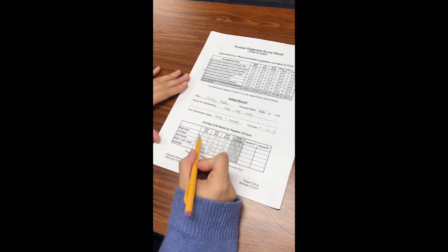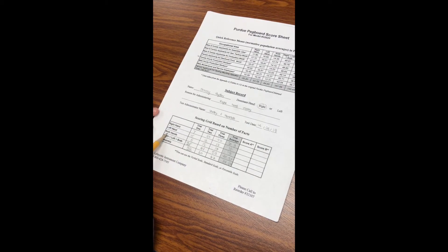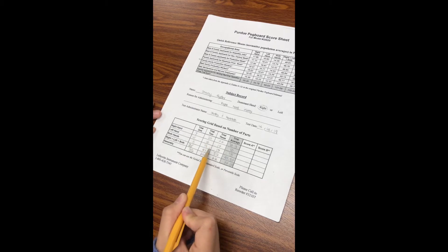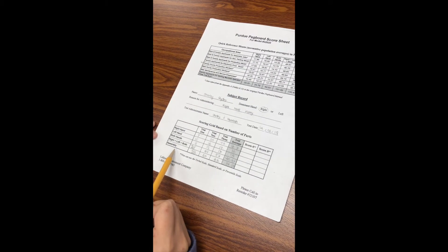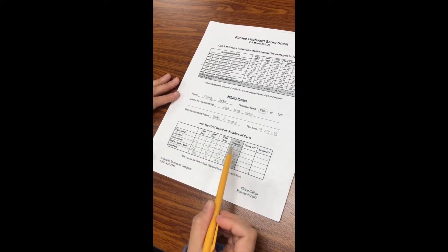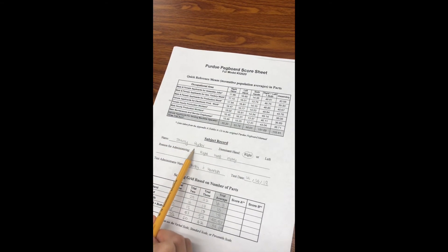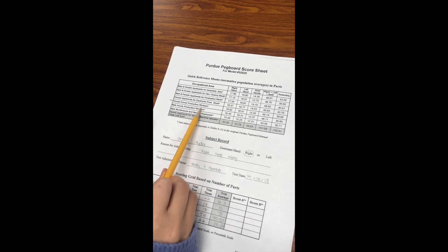After completing the three trials for each individual, you can start calculating their score. For right hand, left hand, and both hands, simply add all the trials together and get the average and put it in the box. For the right plus left plus both column, add the trial scores from each column to get the score for each trial, then add them together and get the average. For assembly, do the same — add each trial score together and divide by three to get the average. After calculating all the averages, compare them using the quick reference guide based on the individual's work type. For our example, since Jenny Ryder is a female that works in an hourly production factory, we'll be looking at female hourly production worker norms and comparing them to the mean.